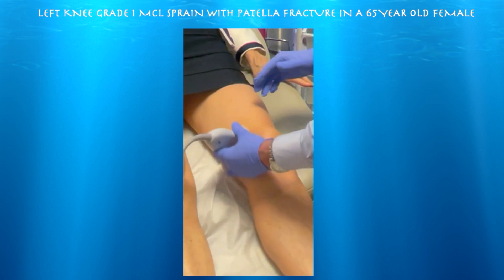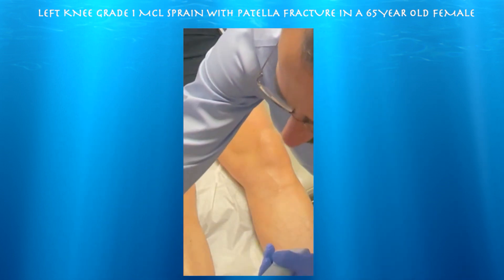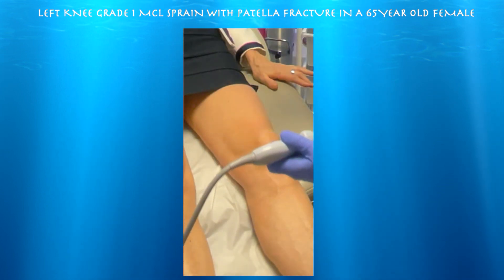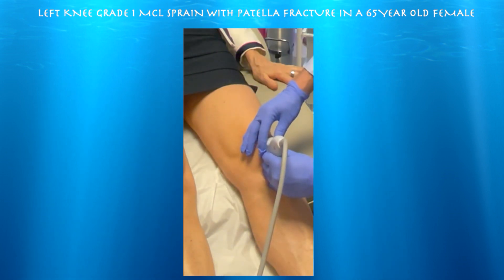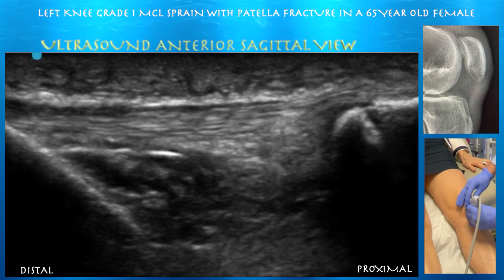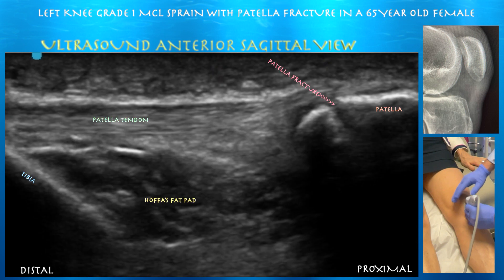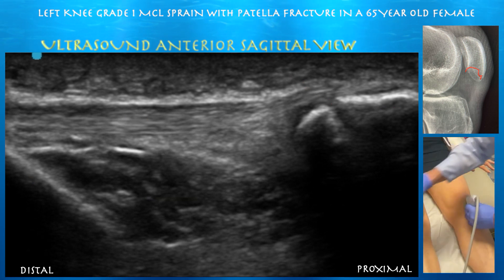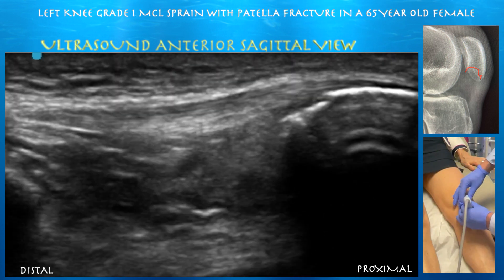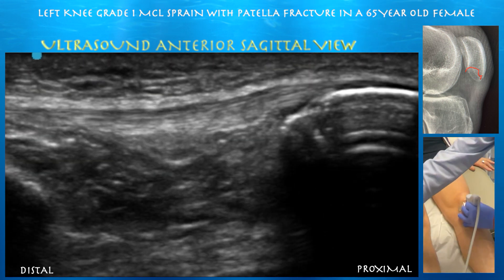Just out of curiosity, we'll see what her patella fracture looks like. We're at 1511 looking at her kneecap. We can see this little fracture — here you can see that step-off in the patella at the distal aspect, consistent with a fracture. The patella tendon looks normal. That's the distal third of the patella — that's where your fracture is.